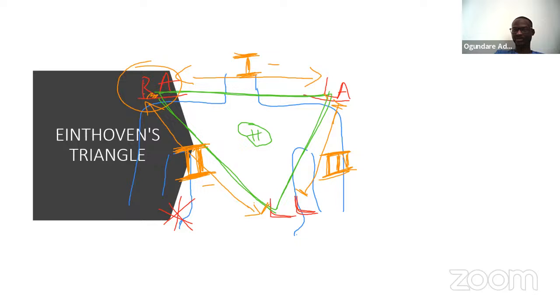Then you know you need to adjust the electrode you've placed on the right arm. Probably it has fallen off, or there is a lot of hair on the patient's hand, or the cable is twisted. So when you are troubleshooting, it gives you an idea where this is coming from.